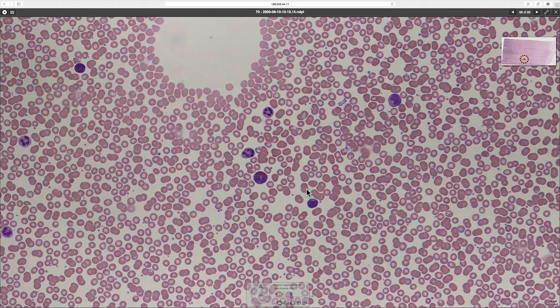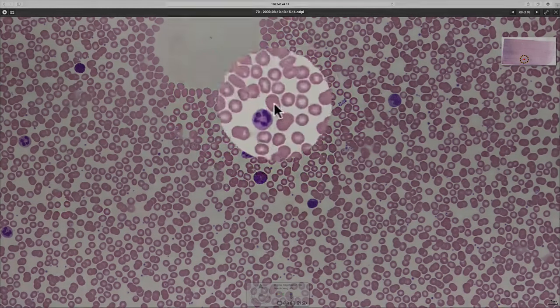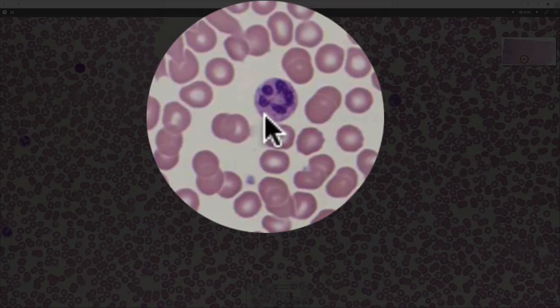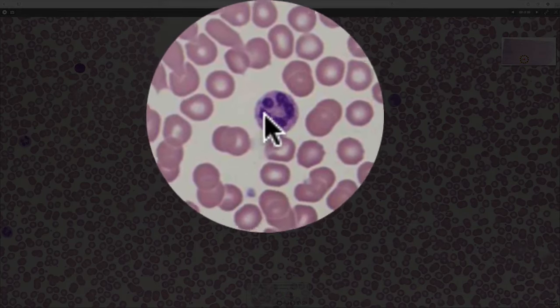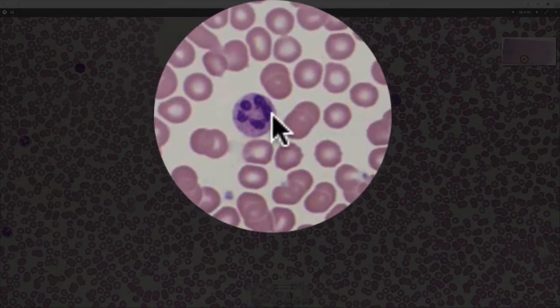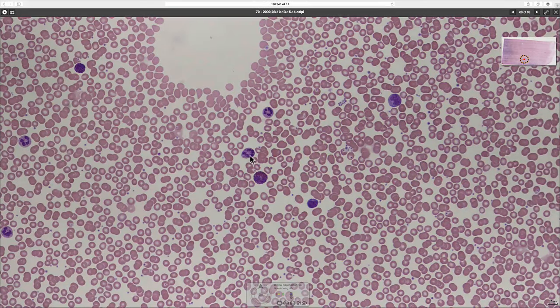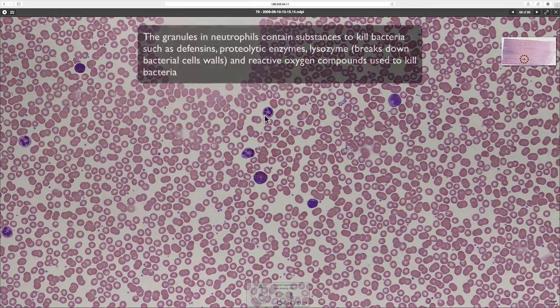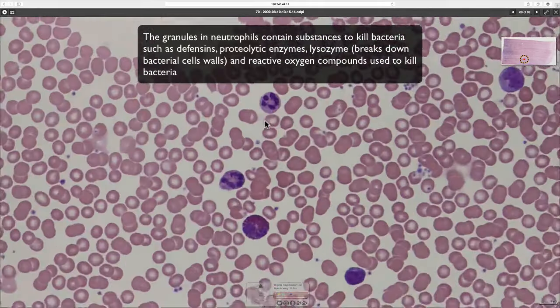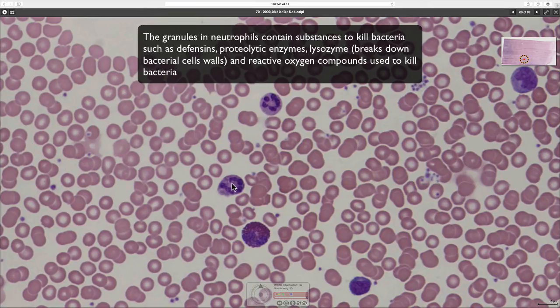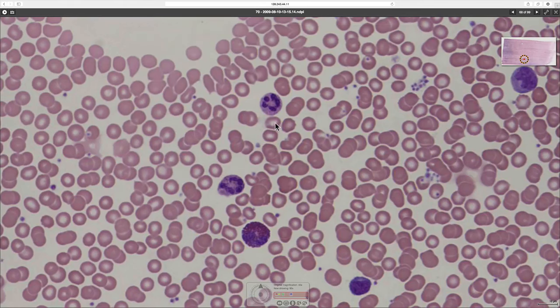Looking at the most numerous cell type in the granulocyte series first — these are the neutrophils. Neutrophils are sometimes called polymorphonuclear leukocytes or PMNs, because the nucleus has several different lobes to it, making it a multiple-shaped or polymorph nucleus. They don't immediately look like they've got granules in their cytoplasm, but the cytoplasm does look a little granular. That's because the granules are neutrally staining — they don't stain positively with either the haematoxylin or eosin component of the stain, hence the name neutrophil.